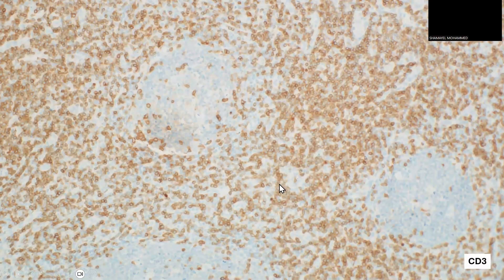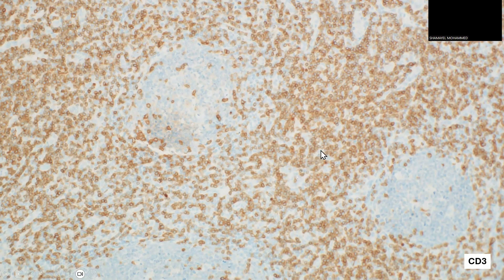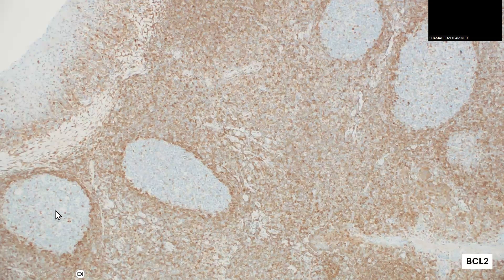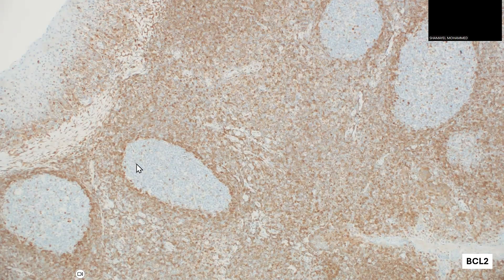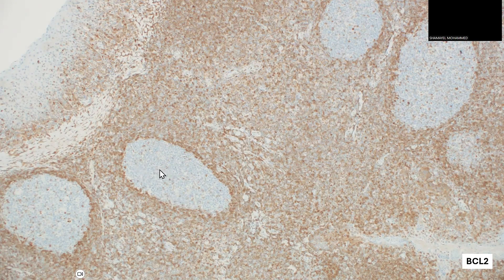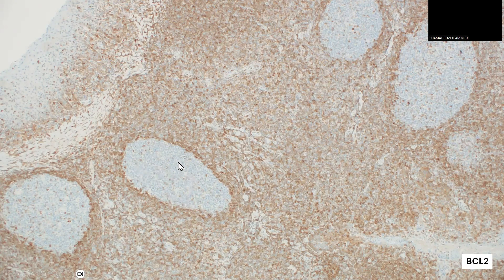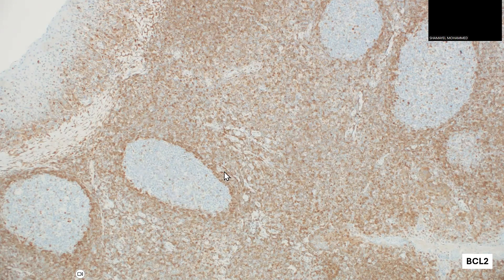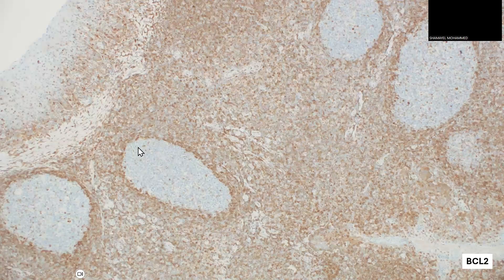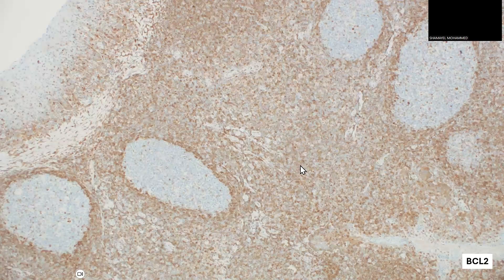There are normal native T cells within the germinal centers called T follicular helper cells. This is BCL2, and this shows a reactive pattern where BCL2 should be negative in the germinal centers because it is an anti-apoptotic protein — it needs to be silenced. If it is mutated and activated, it will lead to uncontrolled proliferation of neoplastic cells, leading to certain lymphomas. So BCL2 is negative in the germinal center, positive all around in the mantle zone and T cells. Some positivity within the germinal center is mostly from native benign T cells.